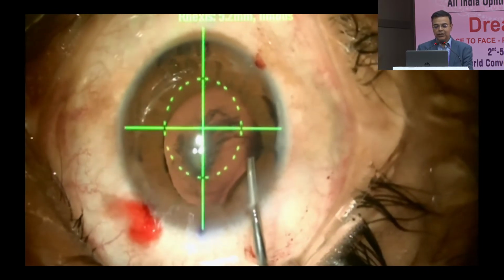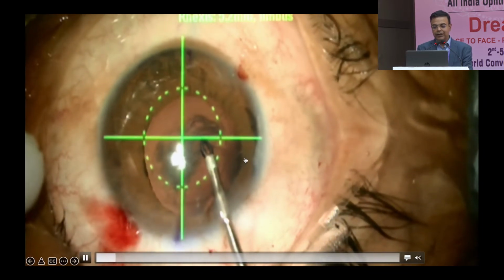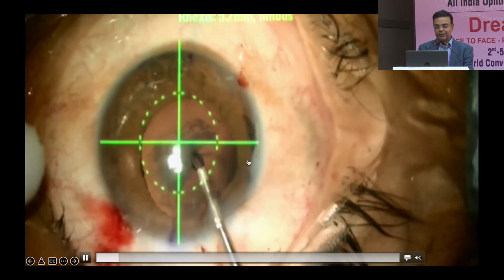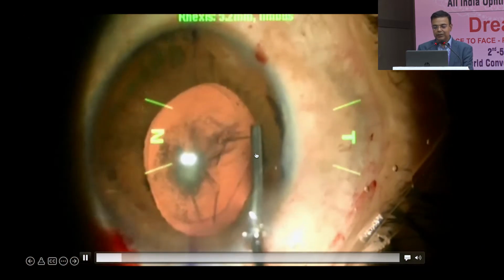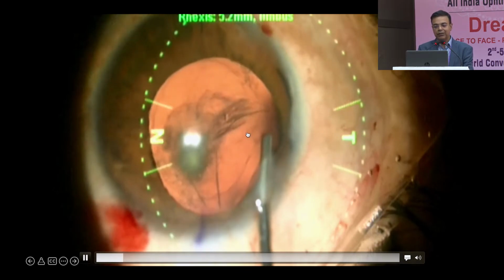So as we started doing the rhexis and I had taken almost a full round, I realized that in the same area where there was iris abnormalities and there was a problem with the pupil, the rhexis started running out. So you will see that it has already run out till here, and in spite of my best efforts using the Brian Little's maneuver and every possible maneuver, it would just not want to come back. The capsule was also fibrous under this area of the iris for whatever reason.